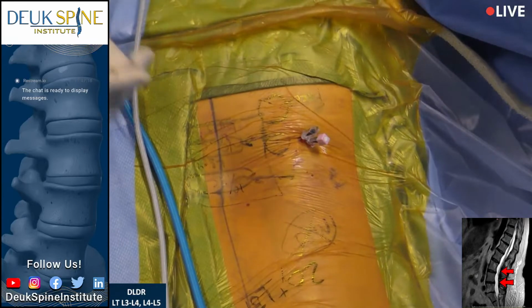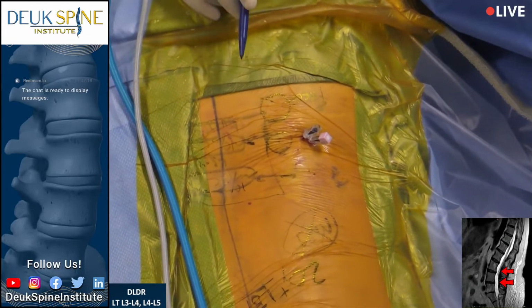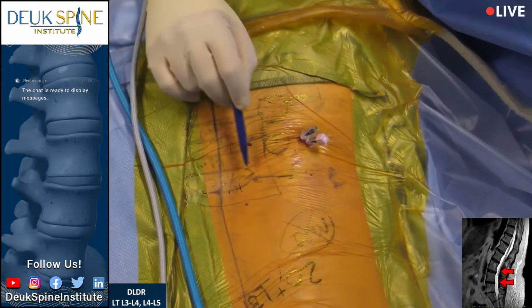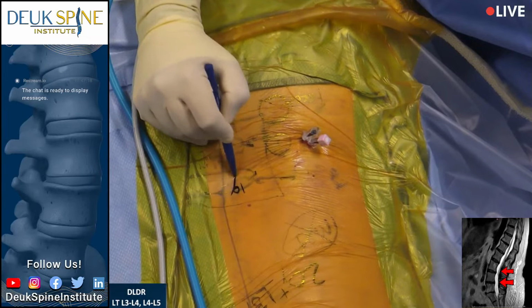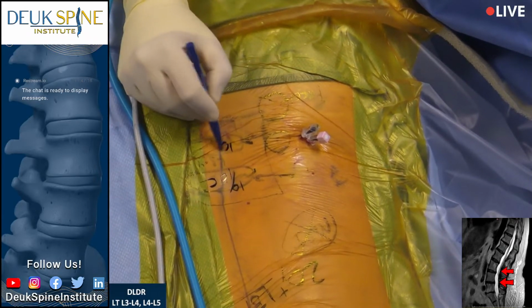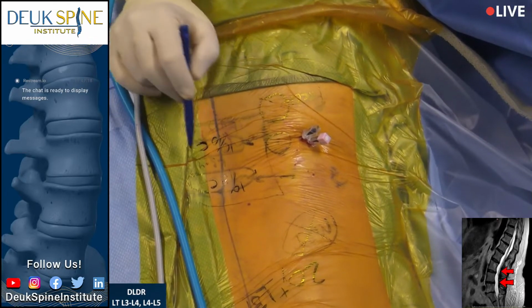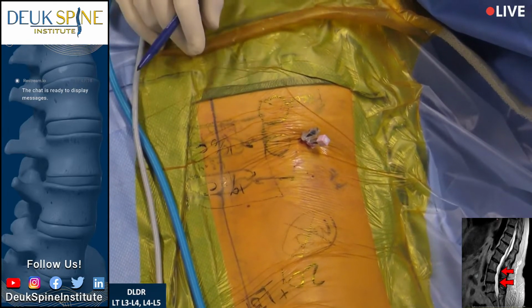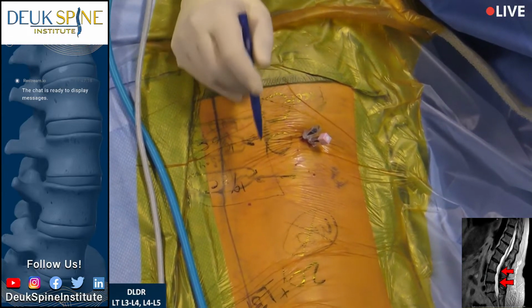All right. While she's counting in German, I'm going to just review what we've got so far. We just tested the L3-4 and the L4-5 disc. They were 10 out of 10. And she's tough German, so she didn't yell out and cry. I would have yelled out and cried. Maybe you would have too, but she didn't. But she said it's 10 out of 10 when we tested them. Now, you're doing great. Just keep counting.